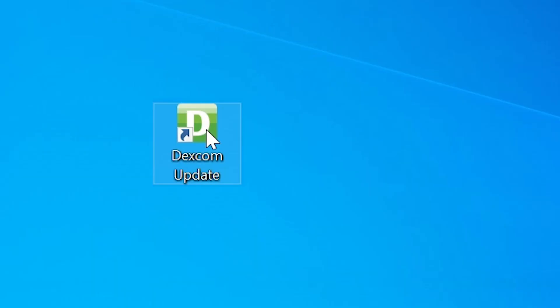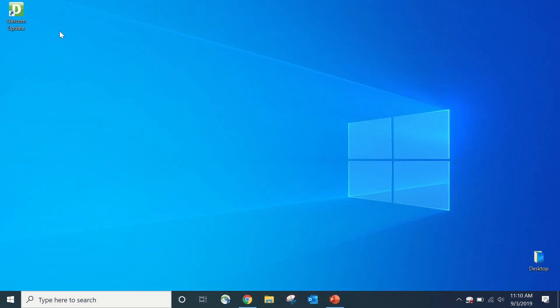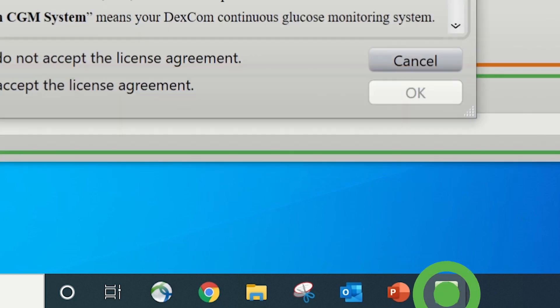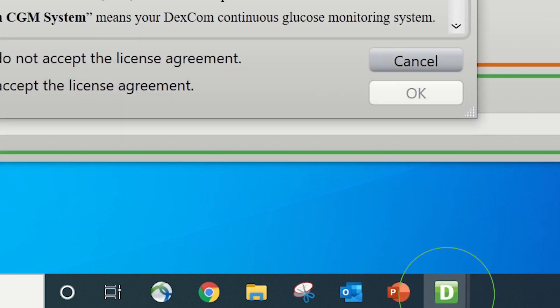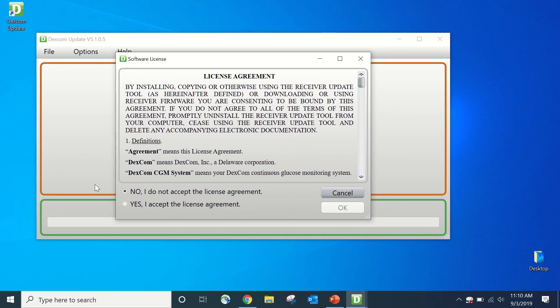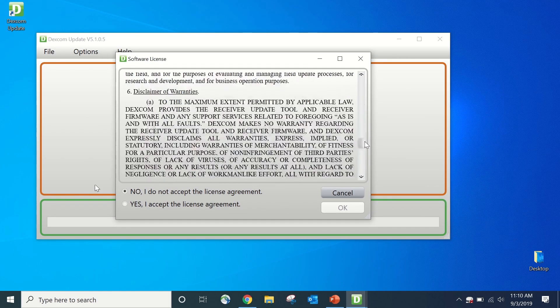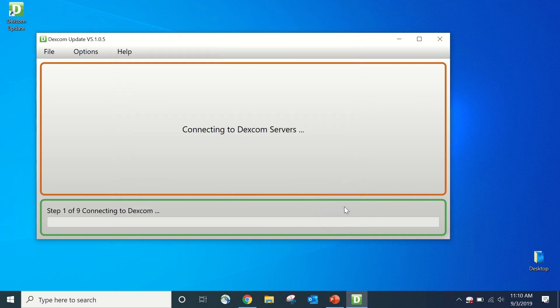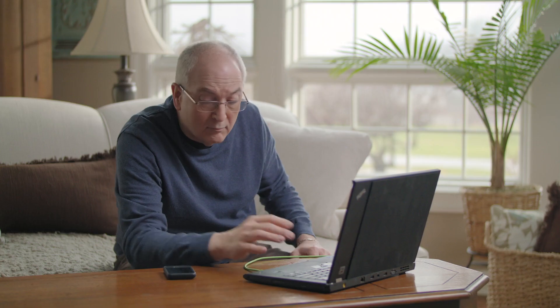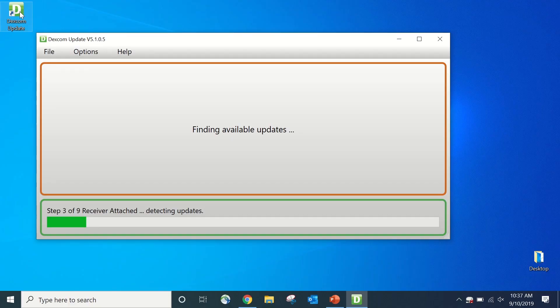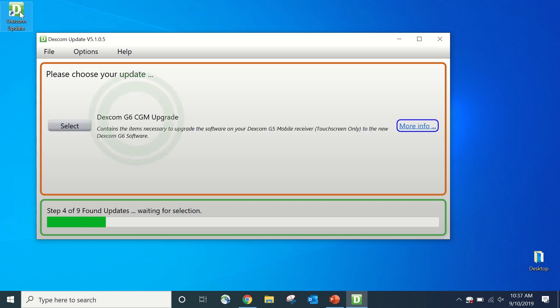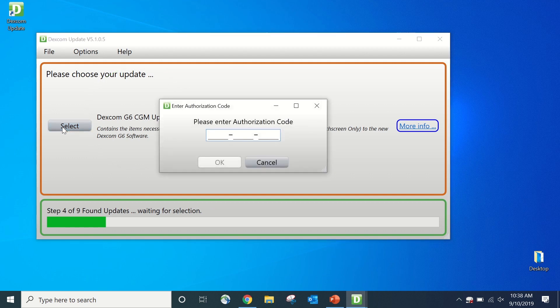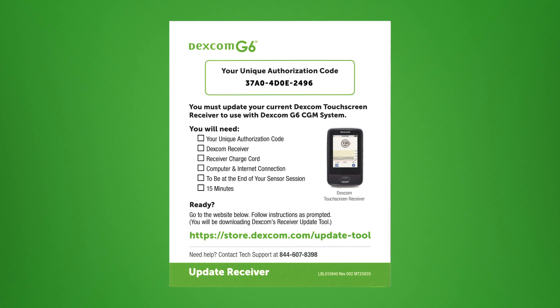First, double click on the Dexcom update tool icon, which will be located on your desktop. If you have a Mac, it will appear in the lower right corner of your screen within the toolbar, or you can open Finder to search for the Dexcom tool. The software license agreement may pop up — after reading through it, select Yes and then OK to accept. Connect your receiver to your computer with the receiver charger cable plugged into your computer's USB port. Once your receiver is connected, the tool will check for updates. Select the Dexcom G6 CGM upgrade, then enter the 12-digit authorization code provided by Dexcom and click OK.